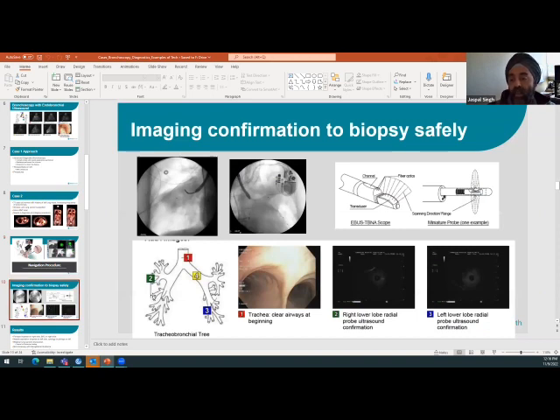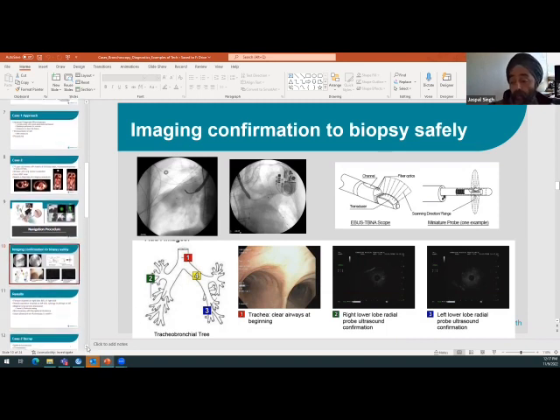If the computer stinks, we have backup imaging, like X-ray. In this last patient, we can do X-ray to modify. Our little catheter there is right in the area. And we also have, remember that ultrasound picture, that last ultrasound we talked about was called the linear ultrasound. We also do a circular ultrasound, which just didn't come out so good picture-wise, but it shows that we're in a dense piece of tissue, that we're pretty much in the right spot. So we can kind of confirm where we are. These are all image guidance enhancements before we get to robotic.